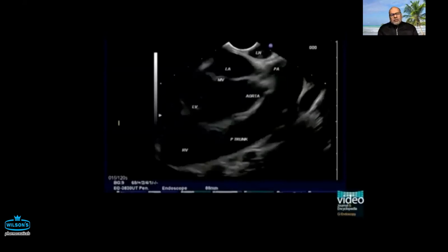So those lymph nodes which are less than 1 centimeter, which you think are reactive, elliptical or triangular, and the characteristics are not matching what is taught, probably you can leave them alone if you don't have any other pathology also.